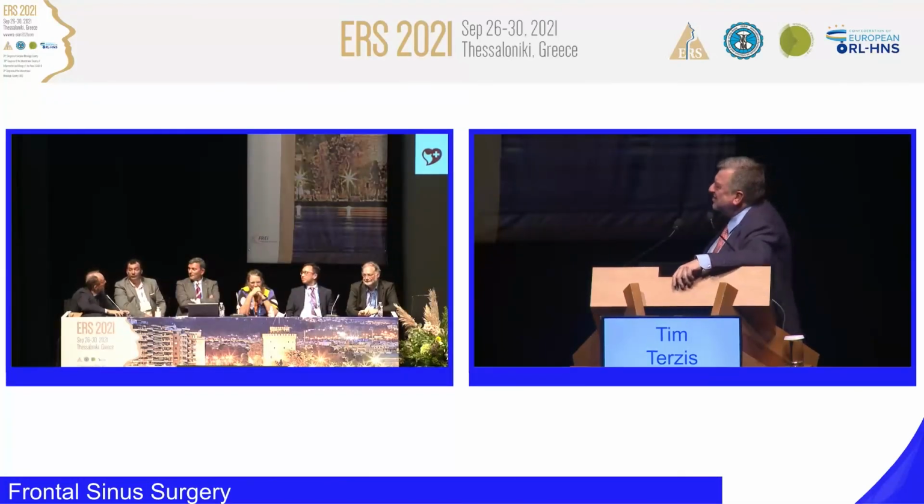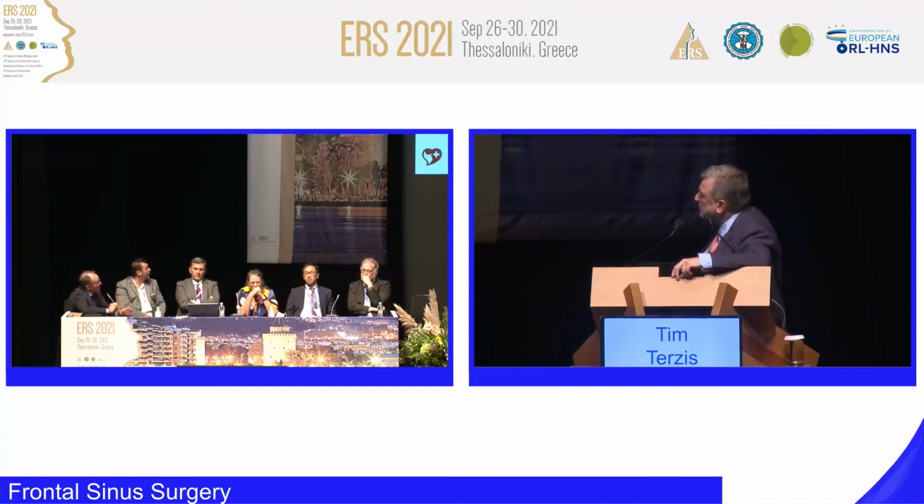That's a lovely case, I think. Case 8A looks to have a little bit of osteoneogenesis, so when you want to open it, I think you have to open it. And in this case, maybe a drug-eluting stent would help. I have a series of these, and they are quite good in this case. Once again, it depends on the local situation, but this is an option you should keep in mind.